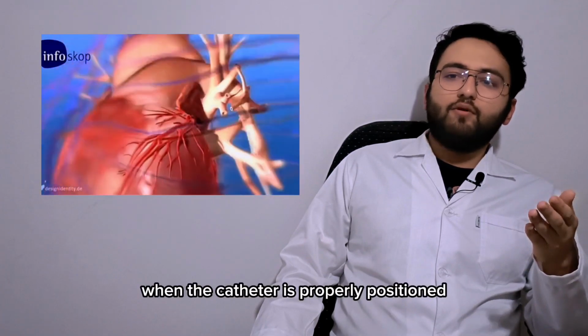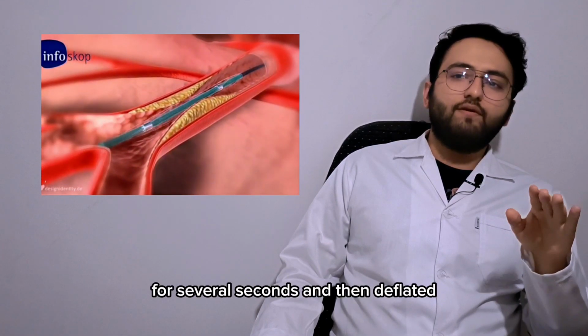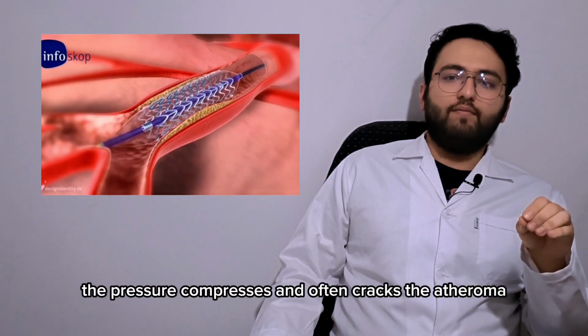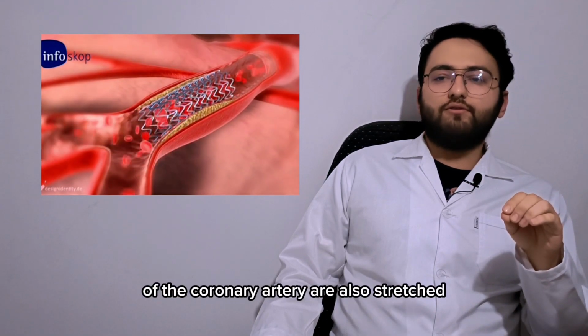When the catheter is properly positioned, the balloon is inflated with high pressure for several seconds and then deflated. The pressure compresses and often cracks the atheroma. The media and adventitia of the coronary artery are also stretched.